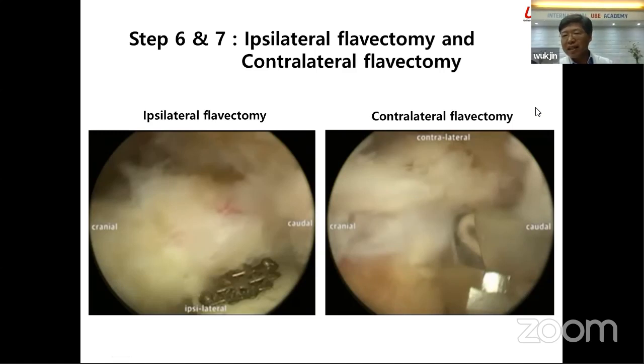We use the normal position, okay? I recommend, in microsurgery I always use a slight kyphotic position, using a Wilson frame to widen the interlaminar space, but in UBE, the neutral position is important. I think a kyphotic posture makes more epidural bleeding. So I recommend just a neutral position. Yeah, that answers Rajmani's question.